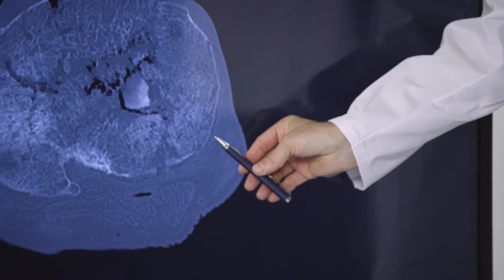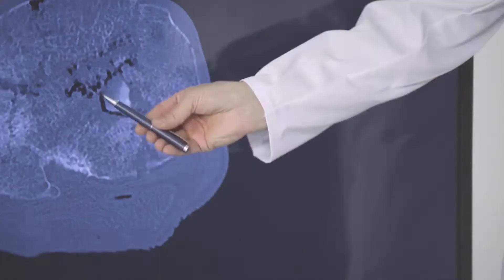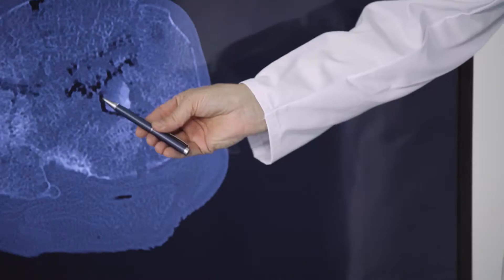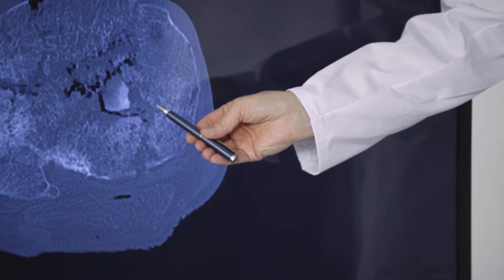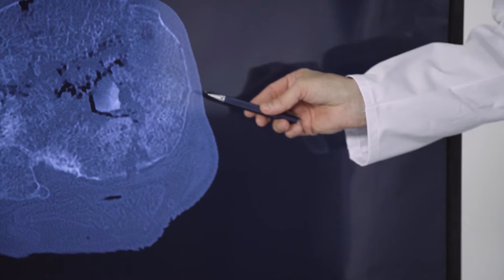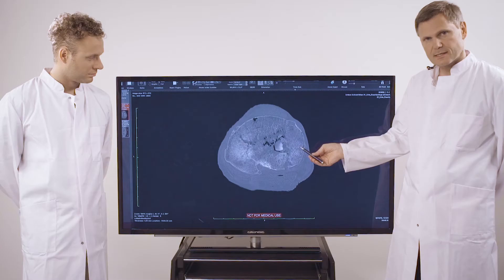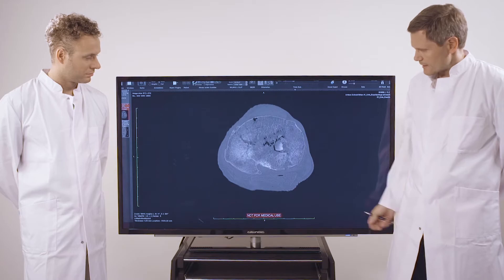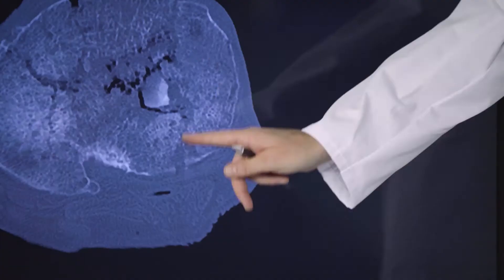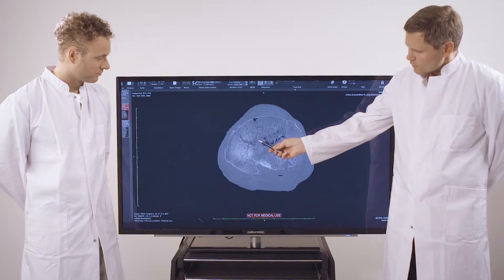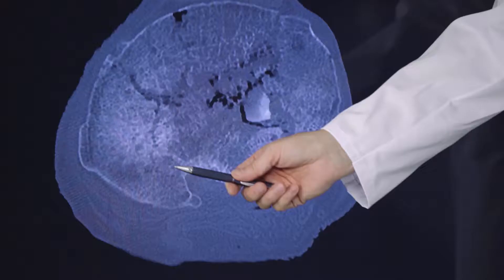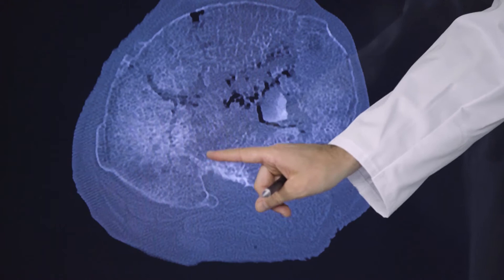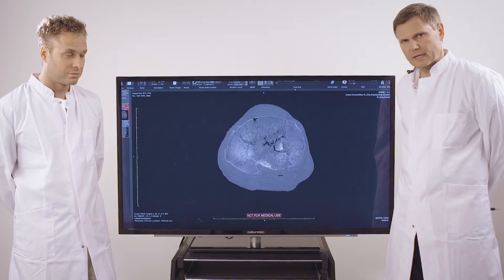Our strategy is to treat the fracture as follows. First, we are going to use a lateral approach to fixate the lateral and posterolateral main fragments. This central fragment will be difficult because the region is very hard to get to. The plan is to extend the lateral approach via an epicondylous osteotomy in order to examine the central parts here. Then we are going to raise this fragment, look at it from lateral, reduce it, and fixate it. Eventually, we will probably use another two screws to refixate this fragment in jail technique. Medially, we will need a plate from posteromedially that basically fixes and supports the entire medial plateau — we will need a buttress plate. The entire procedure will be carried out in prone position.